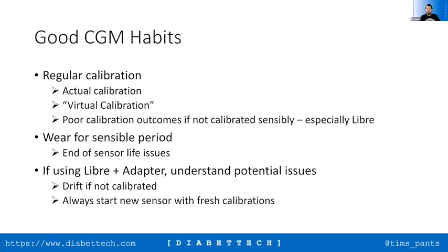What I would say is that people who have run G6 and actually done tests against blood have found that sometimes you do get variation that perhaps you weren't expecting, but in general, the G6 for most people is pretty good. But it is worth checking just to see how it works for you. For example, I've found when I've run some of the tests recently that some of the sensors have been reading between 5 and 10% higher than the blood levels are coming out at. So it's not necessarily perfect.